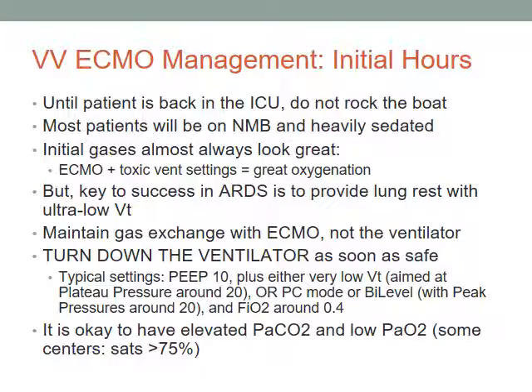So the patient's ventilator settings are high and dangerous. He can live another 20 minutes with them. I may turn down a little bit, but not very much. Most of these patients will already be on a neuromuscular blocker and heavily sedated initially. We don't try to keep them that way, but initially they usually are. And the initial gases look amazing because you've got poisonous vent settings coupled with ECMO, and that equals wonderful gases. It's like, oh, look at this, PO2 is 200, the CO2 is 35, aren't we great?